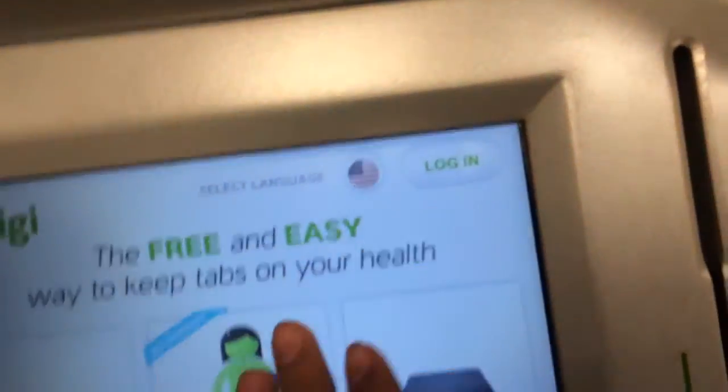So basically, this checks your weight — you sit on here, this is how it is. You create an account with them. That's a camera too, I'm not too sure about that.